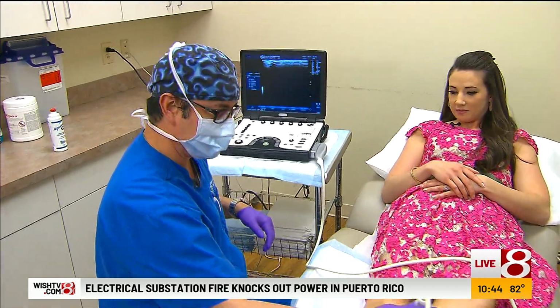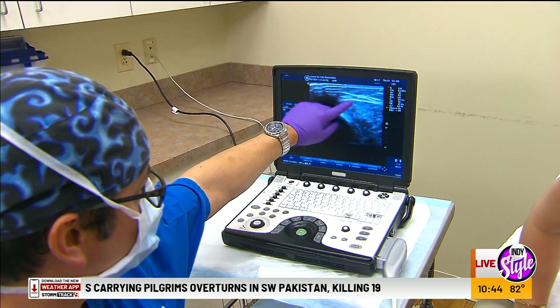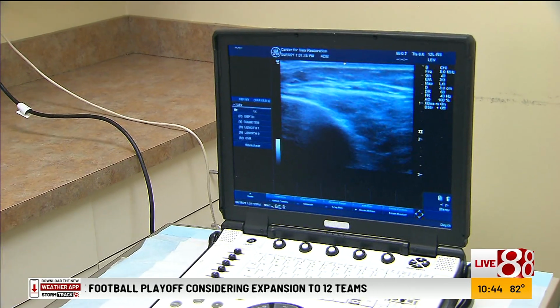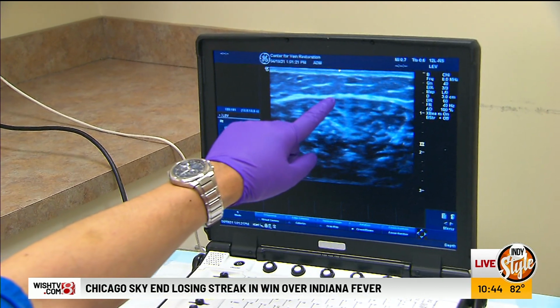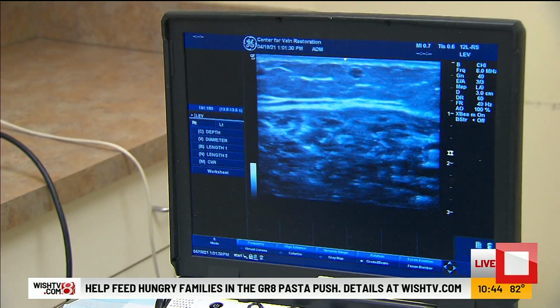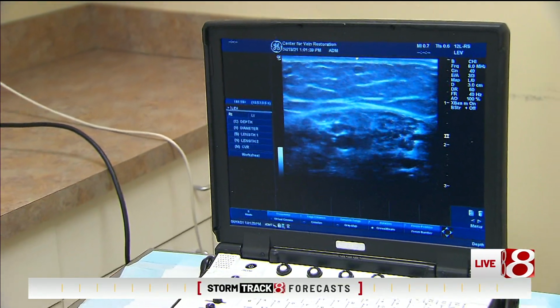Right. And so here, your veins look pretty normal here, normal size in the calf area here. That's called the saphenous vein. About 60% of vein disease is coming from this guy here in patients with varicose vein disease. But you don't really have much of any varicose veins coming out. Back here, I see a few down there. So the green ones you're seeing are here. Yes. And they're not terribly dilated, probably not quite varicose vein yet, but over the years they may be. Oh no. It's good to know so you can look out for this later down the road. That's right, and we can address it before it gets worse in many cases.